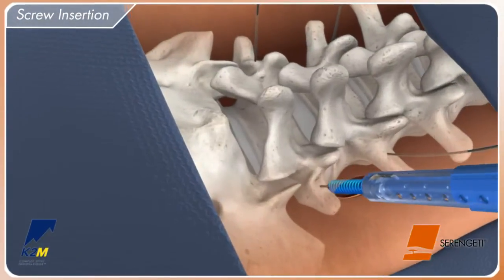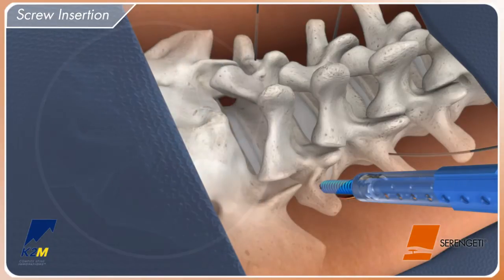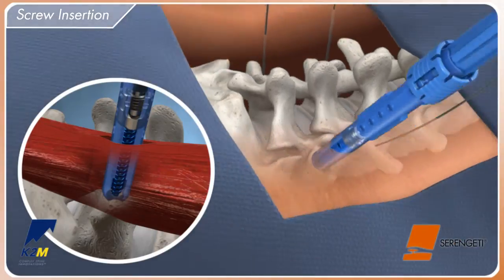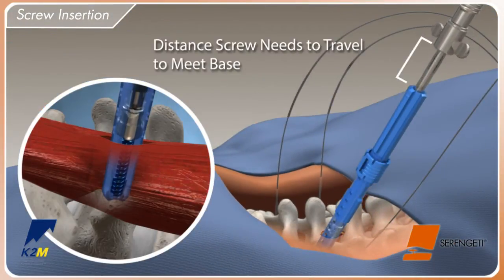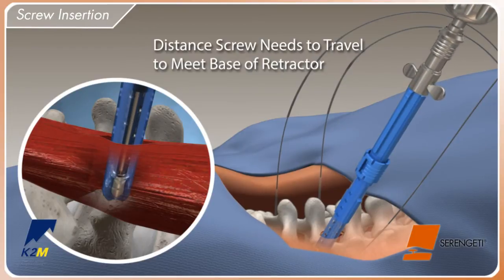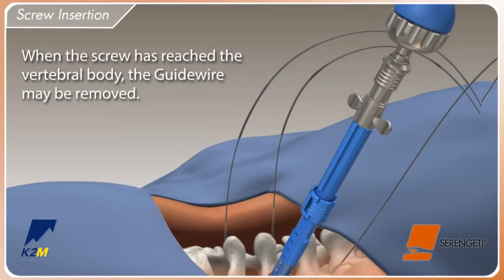Advance the Serengeti screw inserter over the guide wire. Once the screw reaches the pedicle, take a lateral x-ray to ensure the screw is co-linear with the guide wire. Push the Serengeti retractor down to the pedicle to protect the soft tissue during screw insertion. Insert the screw into the vertebral body using the external reference afforded by the blue anti-rotation sleeve to ensure the screw is not advanced too far into the bone.